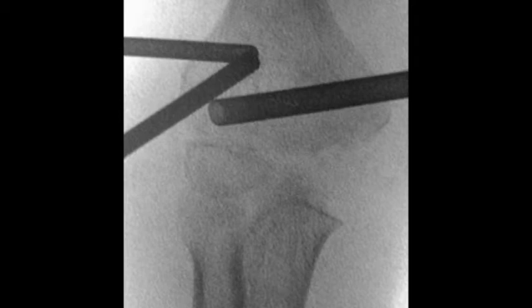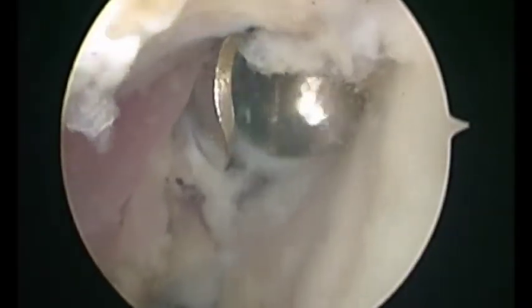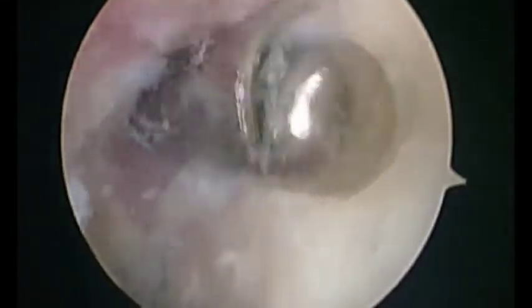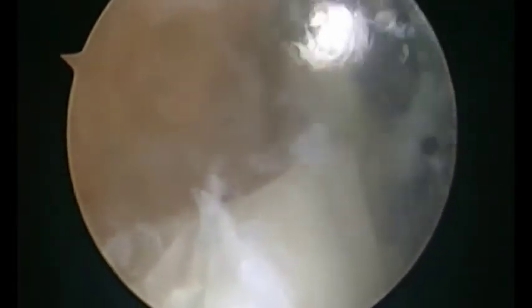A mini C-arm is brought into position to confirm the optimal site of osteotomy is marked and corresponding to our previously templated position. Then a 4 mm burr is used to create a transverse anterior trough across the distal humerus at the supracondylar level. Interval radiographs are obtained to monitor the progress of the osteotomy. The instruments are exchanged between medial and lateral portals to facilitate the bone cut, taking care to leave the posterior cortex intact as a hinge.